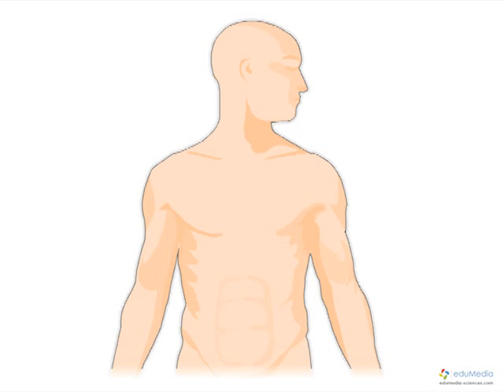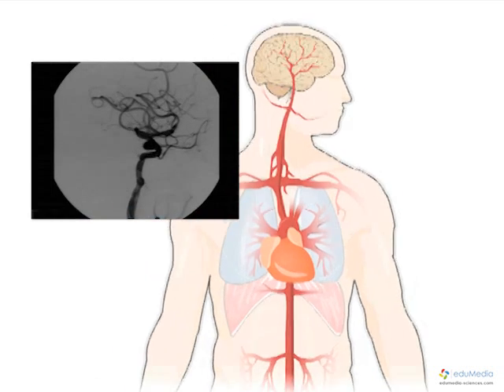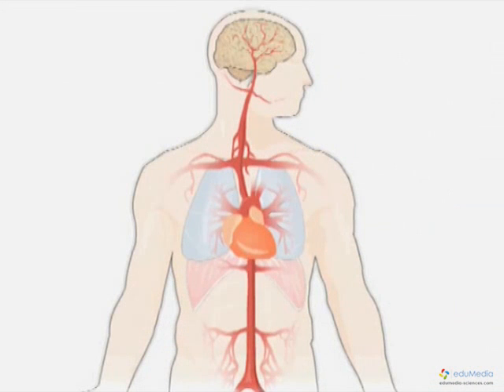The injection of a contrast medium based on iodine into the bloodstream makes it possible to see very fine structures like blood vessels. Thus, to treat an aneurysm in a cerebral artery, that is, a local distension of an artery in the brain, an incision is made in the groin at the femoral artery, and then a very fine tube called a catheter is introduced, which passes successively from the femoral artery to the abdominal aorta, then into the thoracic aorta, so as to go up through the carotid artery to the brain.